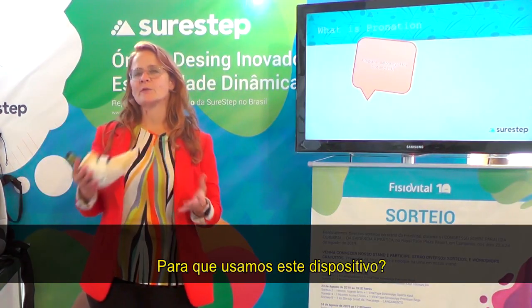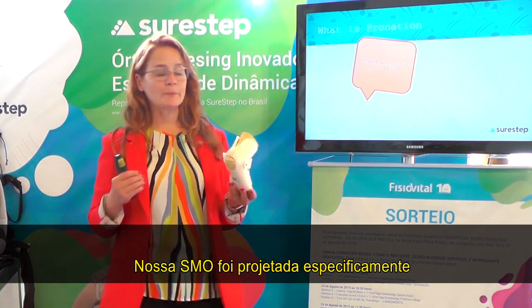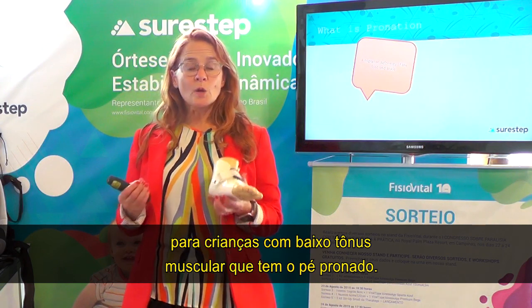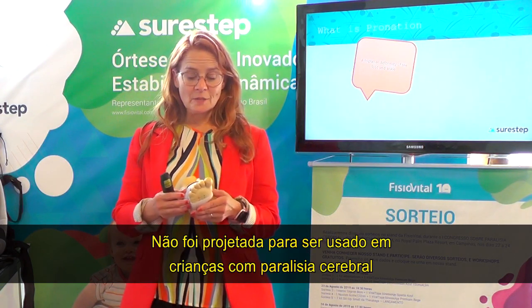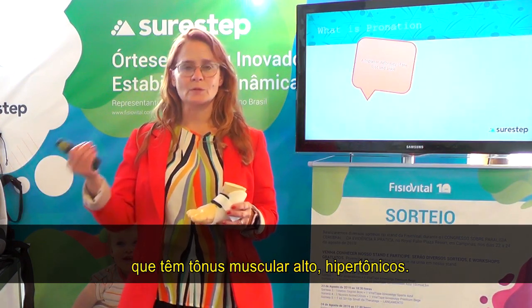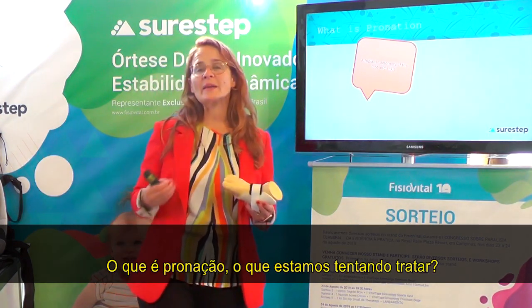What do we use this device for? Our SMO was designed specifically for children with low muscle tone who pronate. It was not designed to be used with children with cerebral palsy who have high muscle tone.